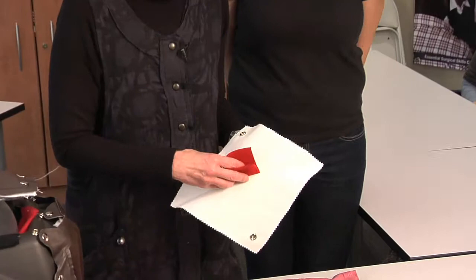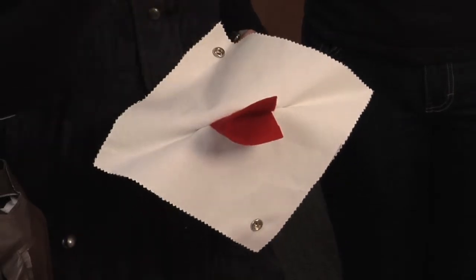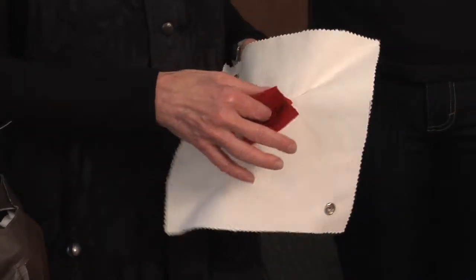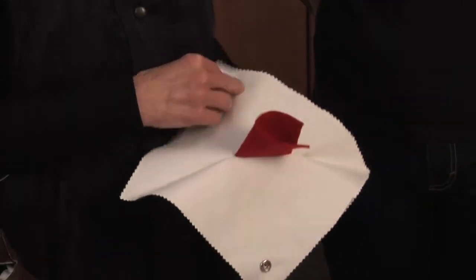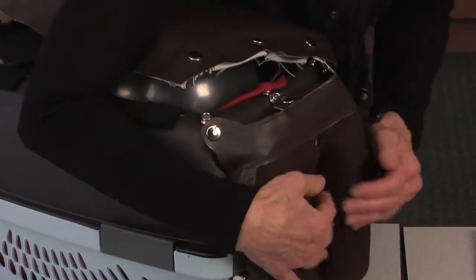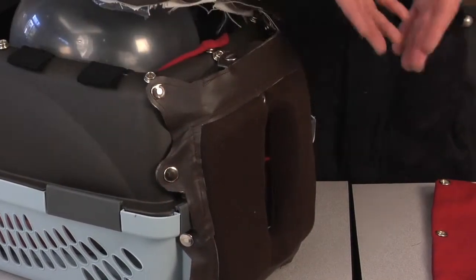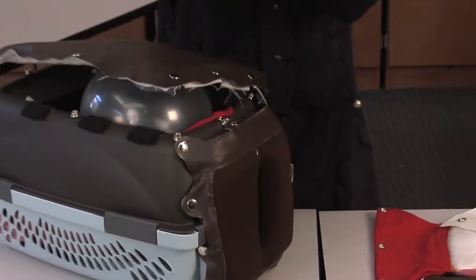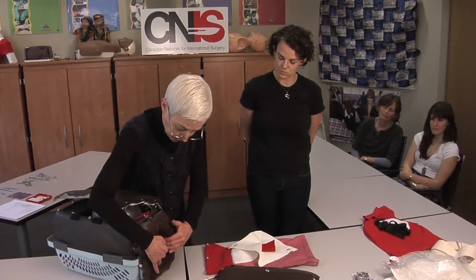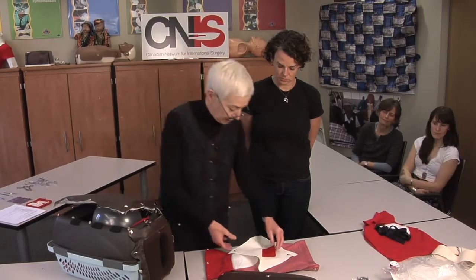This represents the cervix. Sometimes in a delivery there is bleeding that occurs — in a vaginal delivery there's bleeding that occurs afterwards. The student looks for the potential causes of that bleeding, and one of the causes is a cervical laceration. This is a simple model of what the cervix would be, and this represents the laceration. It has to be up inside a little bit, just like it would be in real life, so the student gets the experience of having to work up inside the vagina — instruments need to be a little longer, and they need an assistant to open the walls of the vagina so they can see properly.